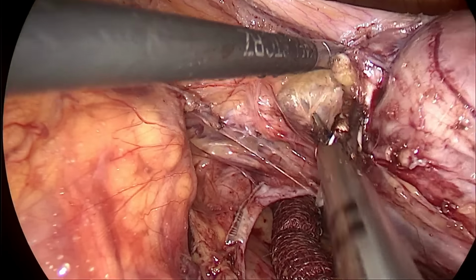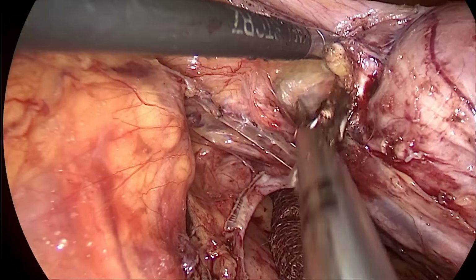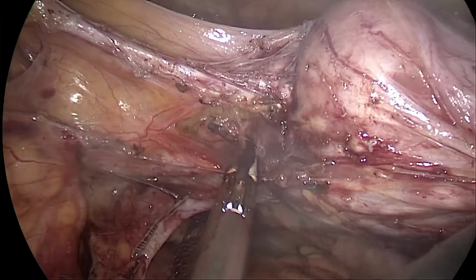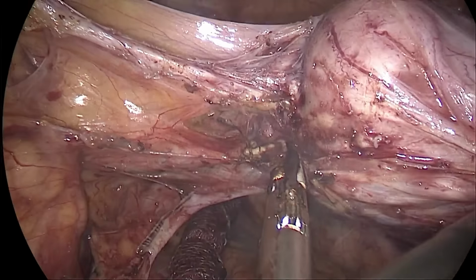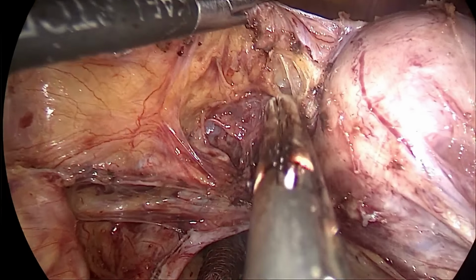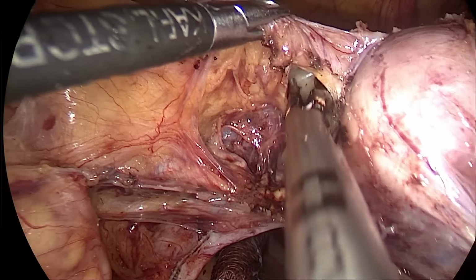That's because in the lateral window technique, the bladder is not adherent on the lateral side, mostly adherent anteriorly. So that's the uterine pedicle of the left side. Partially taken the uterine pedicle, just coagulated, and after that again trying to skeletonize the bladder.